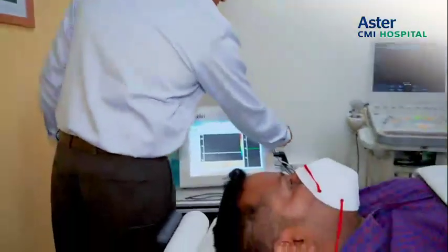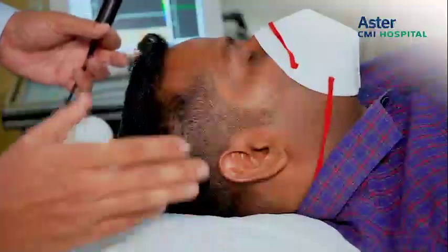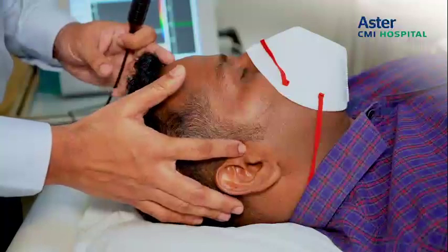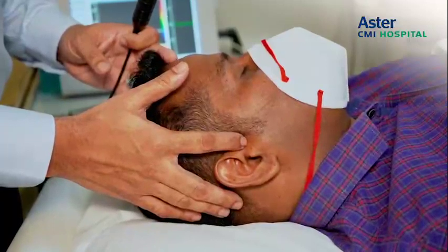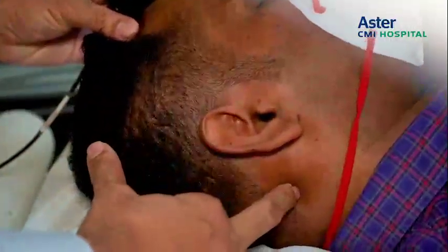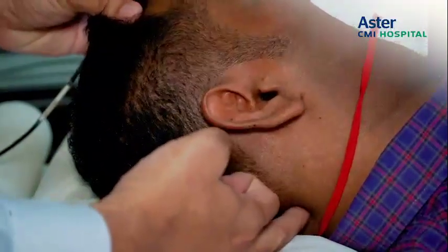So we will demonstrate how we perform a transcranial Doppler. We use this transducer, and here we have a volunteer. There are certain areas in the brain through which we can transmit the ultrasound waves. One is the transtemporal area, where the skull is slightly thinner. The next area is just beneath the mastoid, where we can insonate the vertebral artery, and then we have the suboccipital region where we can insonate the basilar artery.